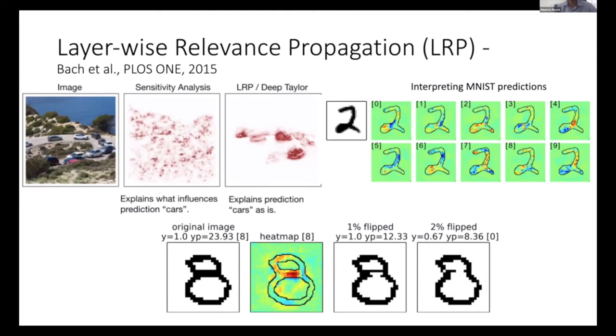And overall, LRP and Deep Taylor, I also have to say, is very similar. I'm not going through it, but it's very similar. I would say, the most robust approaches, if I'm asked what would you use in practice, I would say LRP or Deep Taylor are state-of-the-art approaches for saliency maps.